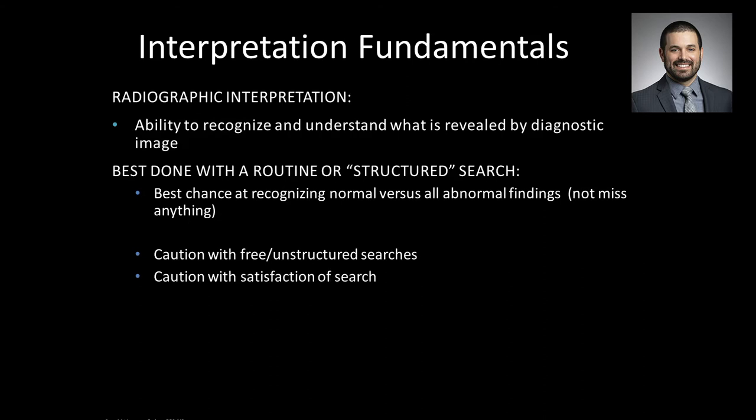And it's actually an example of something called satisfaction of search, which is a really silly sounding term. But if you read a radiology textbook, you'll find it. What that means is a couple things. One, you are preoccupied mentally with, for example, your implant site, and you go straight there and get the information you want regarding that implant site. You are satisfied, so to speak, in your imaging quest, and you forget to look elsewhere for other findings.